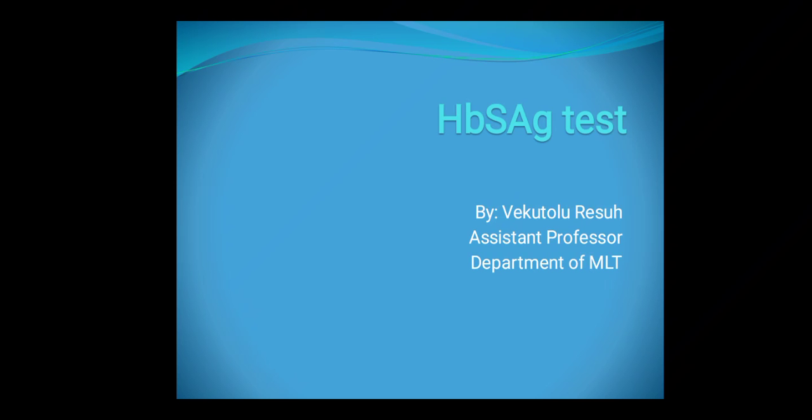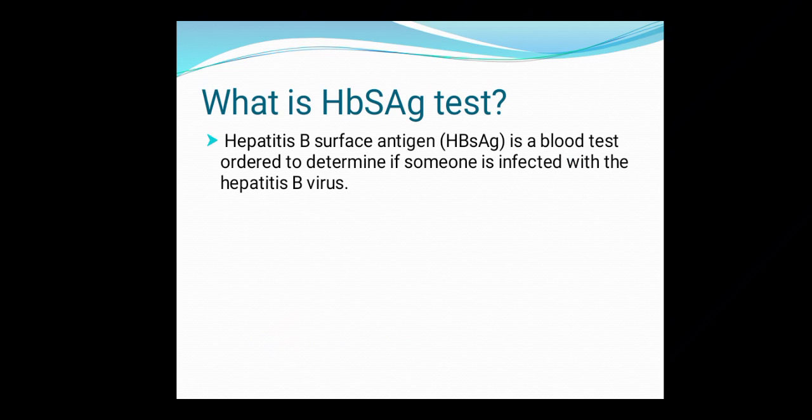Today I'll be talking on a rapid card test of HBsAg. So let us see what is the HBsAg test. This is a blood test to determine if someone is infected with the hepatitis B virus.